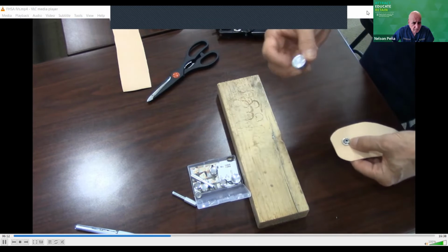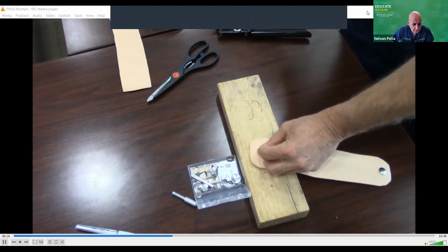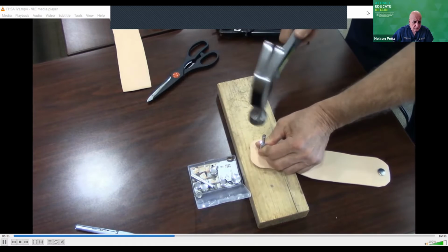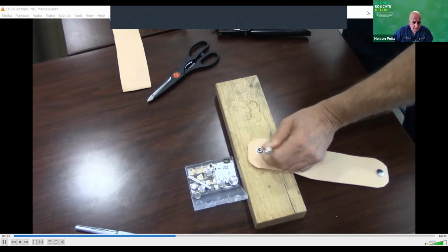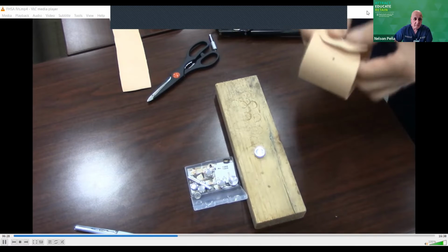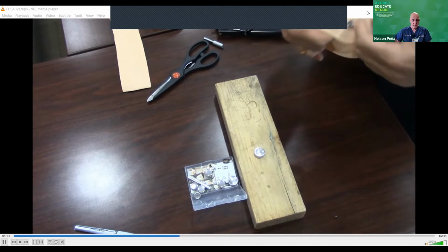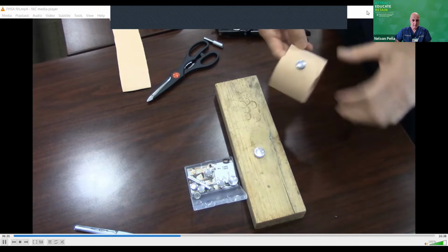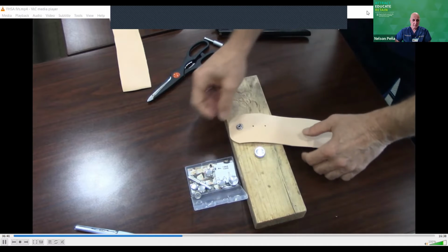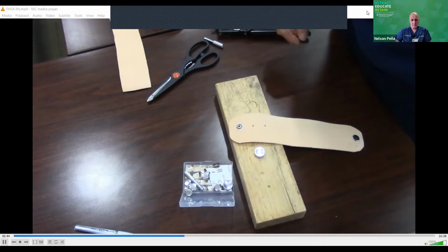And now you're going to take the fastening tool, turn it upside down, put that on there, and then I'm going to smack the other part of it sealed. And voila, now I have a strap I can connect to my simulator. Just like that. Easy on, easy off. Now I'm going to go ahead and put the other ones in place. So I'm going to need to use some more of these.